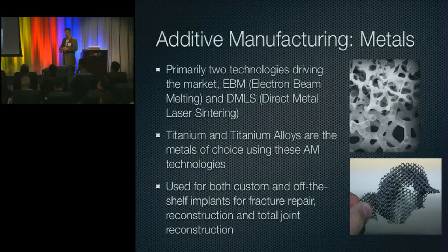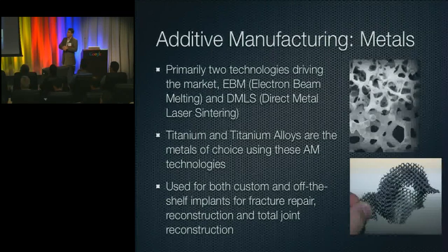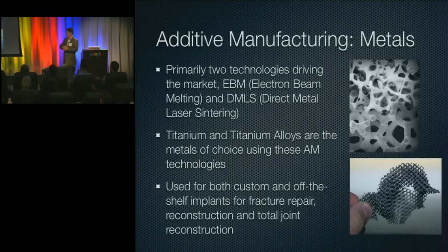It's got to be strong enough to withstand the forces. It's got to have an articulating surface to function against something else. But where it interacts with your bone, you need that to be a really strong fit. And if that fit isn't strong, and the potential for the immediate fixation there isn't good, that implant will loosen and fail. And loosening of those implants is the number one cause of failure of those implants. So the tighter and the more mechanically connected you can fit that implant, the better.